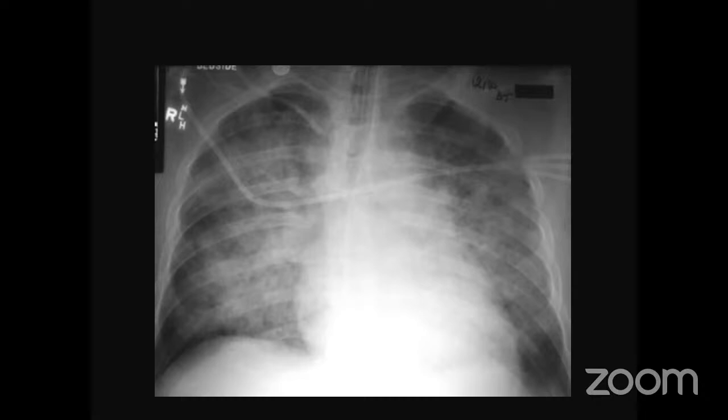That was a great discussion. One of the respiratory physicians, I don't know if Dr. Harris is still here or Dr. Siddiq can answer this. As a clinician, the other problem I quite often face is an effusion on one side. Yes, and then we want to do a CT. Do we need to drain the effusion to dryness before we actually linger upon doing some scans or CT scan, further imaging, not chest X-rays, but CT scans?